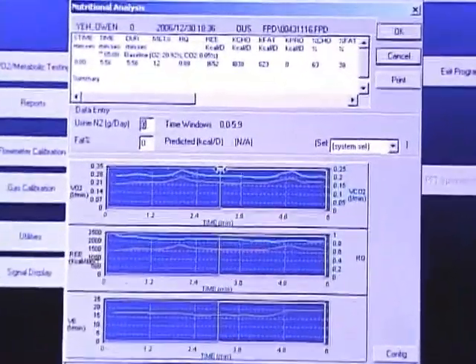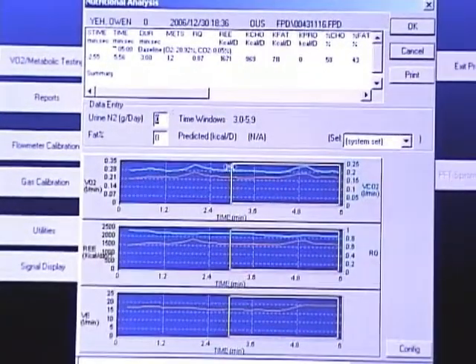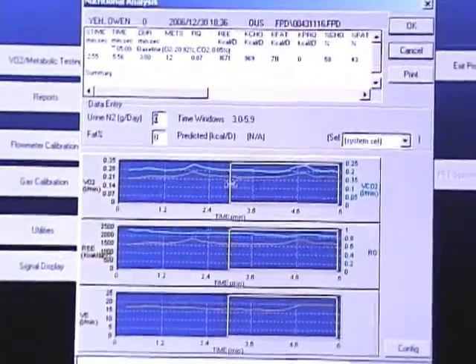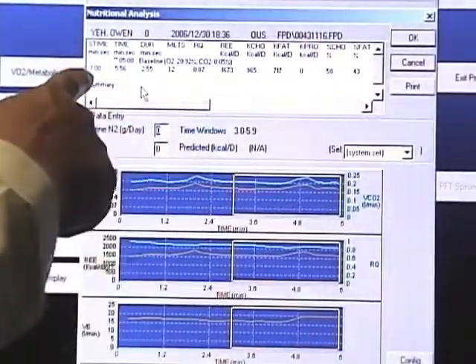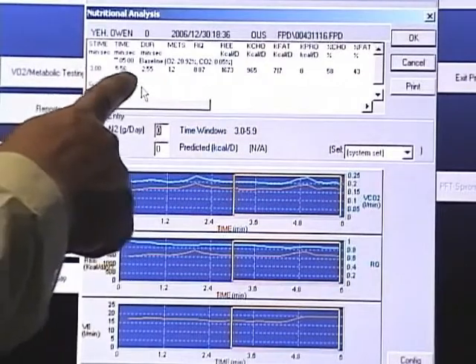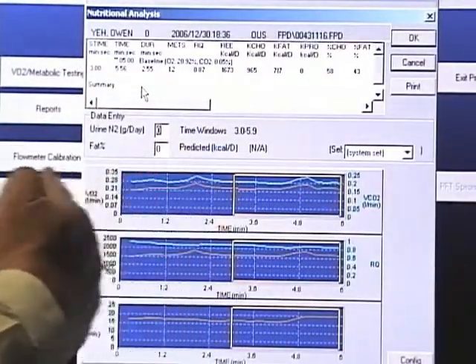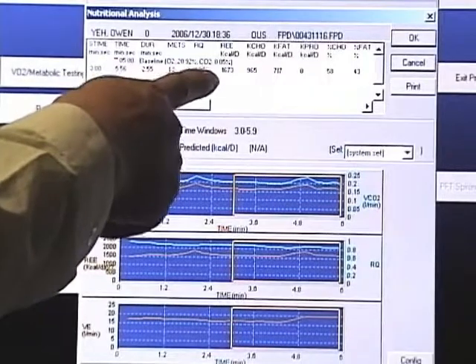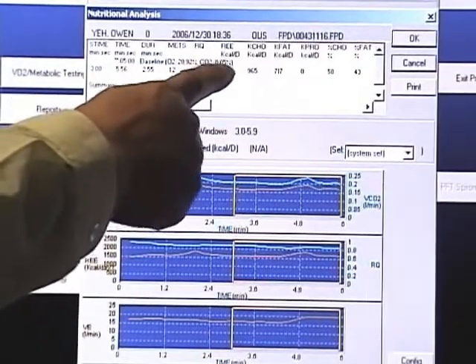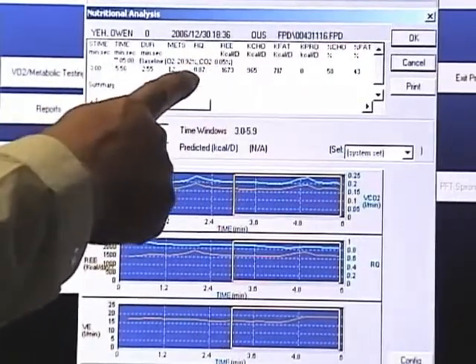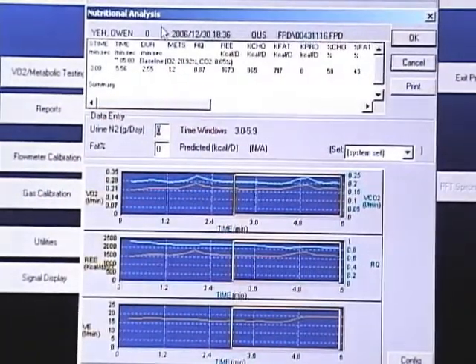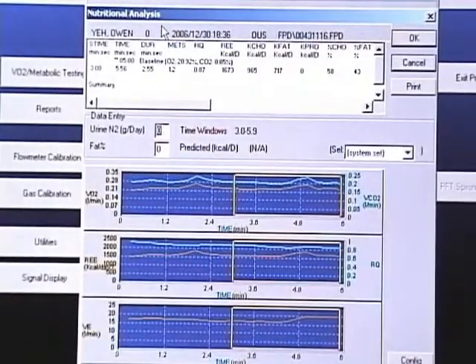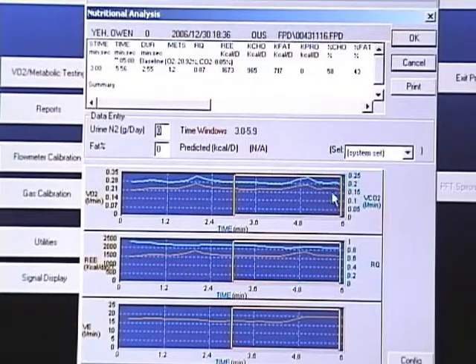For example, in this case, we have the report start at 3 minutes to the end, so it becomes 3 minutes to 5:56, and we can throw away the previous data. The subject's REE is 1673 with RQ 0.87. This is very useful for resting — you can remove the previous unwanted data and just focus on this final piece of data.